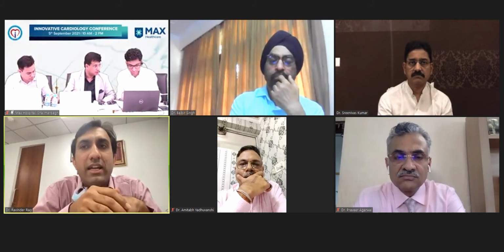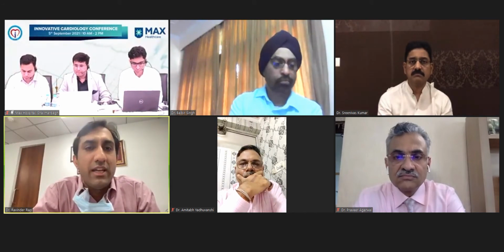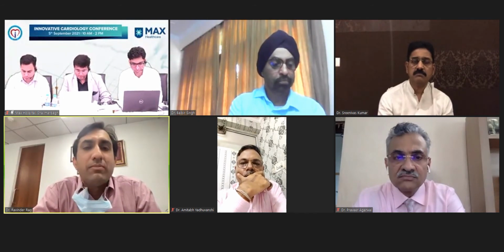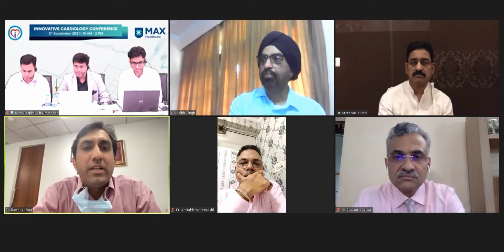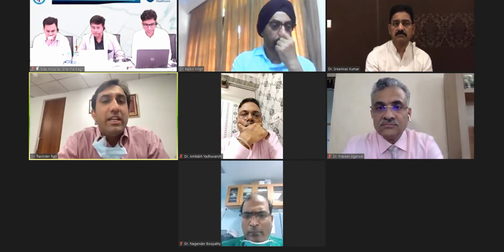Regarding the technicality, it's a very safe procedure because you are on the venous side, you are working in the LA, you are not even on the LV side, and the patient is not hemodynamically compromised. It takes time, and proper understanding of TEE is very important to complete the procedure. The only way a complication can happen is if your clip embolizes or you tear a leaflet. Now, the 3D TEE is a must, sir.